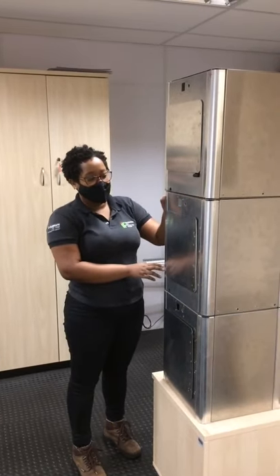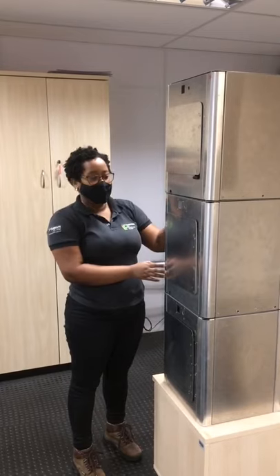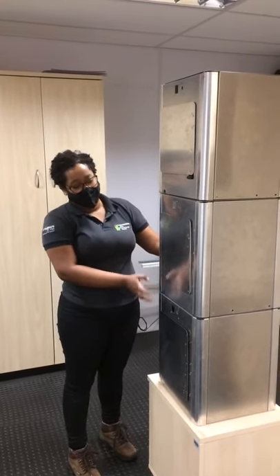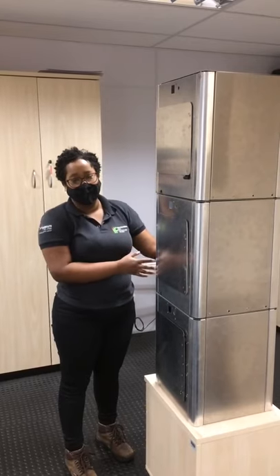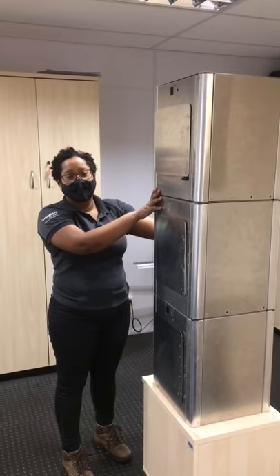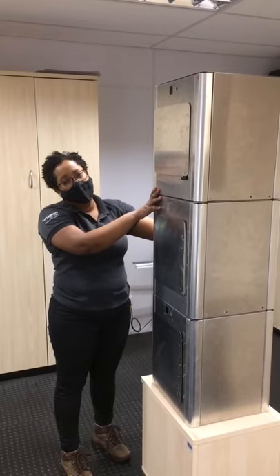Temos dois escravos. Esse primeiro escravo também está funcionando com a porta. Esses dois módulos são os que vão ser enviados para vocês. E o escravo 2, que é o que vai ficar aqui no polo de inovação, que também está funcionando com a porta.